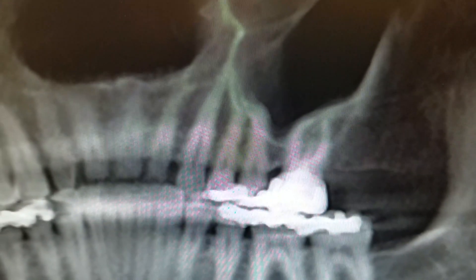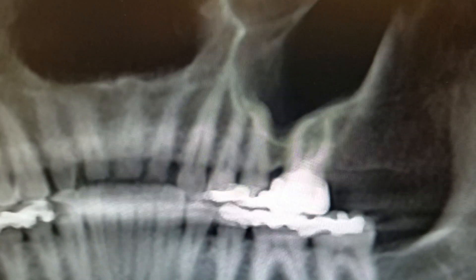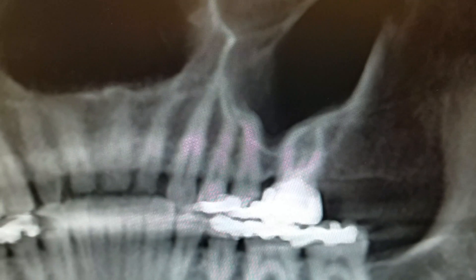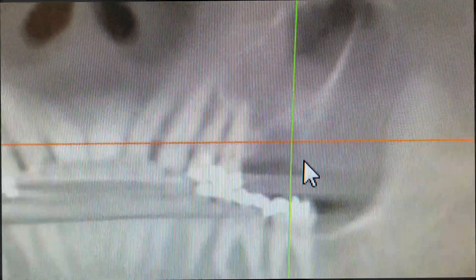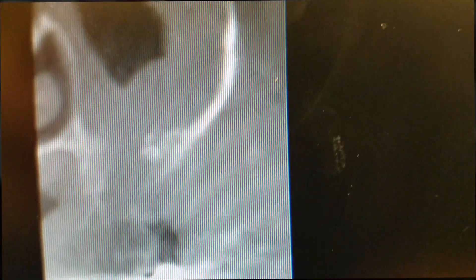We're going to go now to the post-operative radiograph that I took after the patient had had one attempted repair at closure using a buccal sliding flap. I'll show you the scan — here's the post-operative x-ray from the first time I saw this patient.